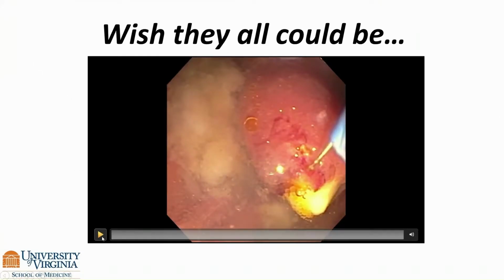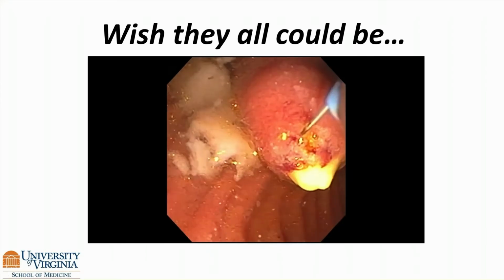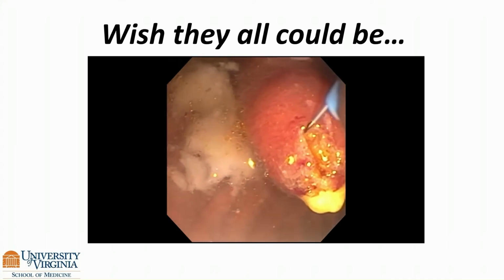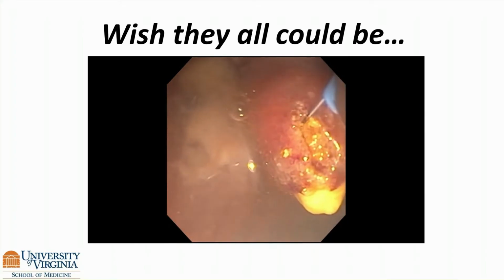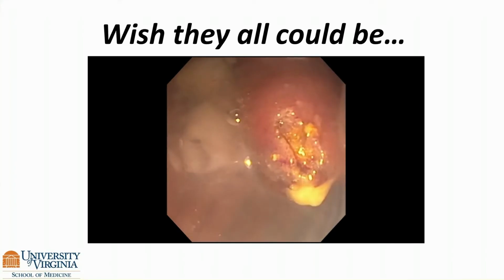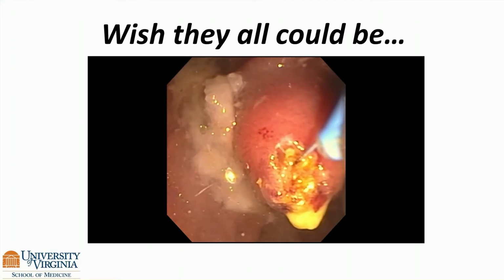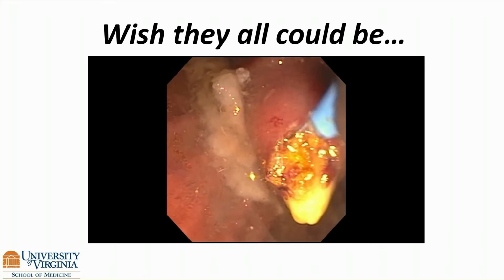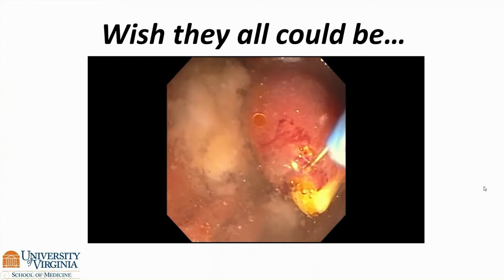This is an example of an impacted stone at the ampulla. And this was one of my fellows from a few years ago, early on in his therapeutic training. And these cases are great. You can use a needle knife, get practice with it in a very safe manner. And you can see just with a few cuts, very easily, this stone is able to be ejected from the bile duct, as you can see here. Again, this is a very safe technique to use the needle knife, and we really wish they could all be that easy.